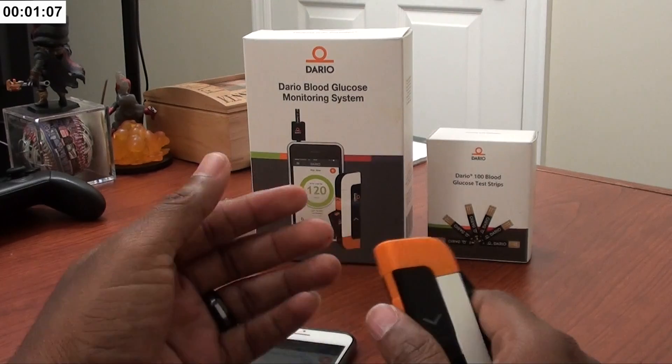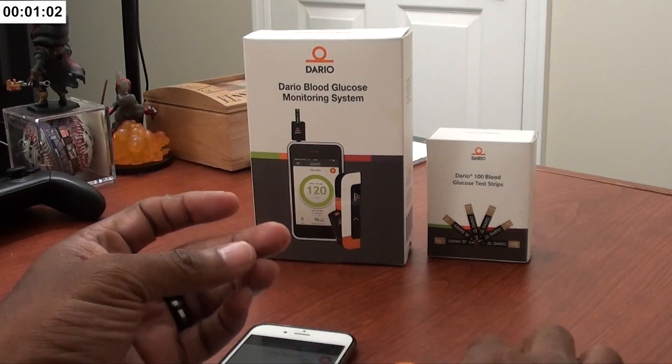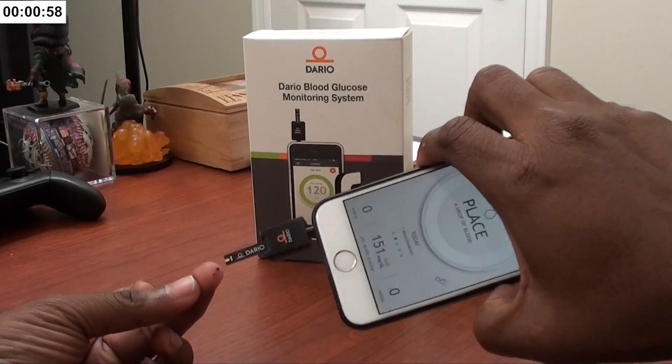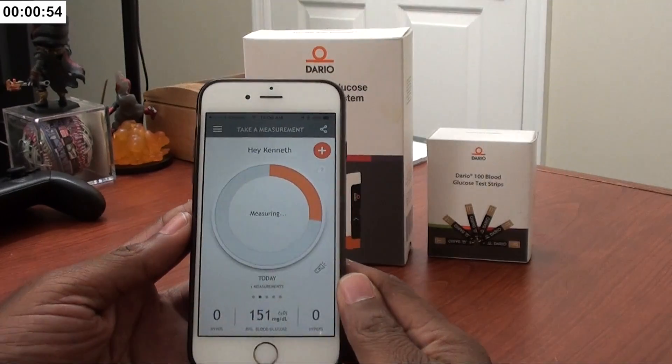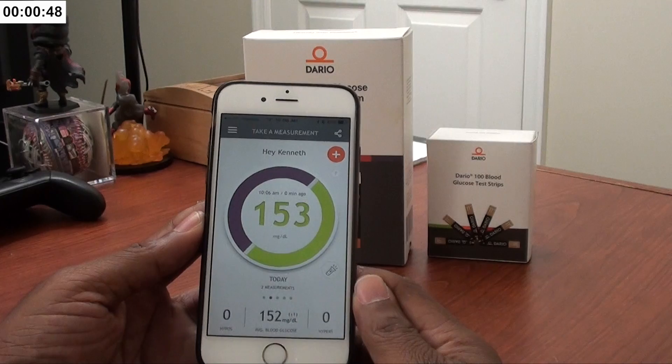If you're squeamish you might want to turn away. Prime it, push the orange button — gets me every time. Squeeze out a little bit of blood, stick it in there, and as soon as you do that you'll see it starts to work.